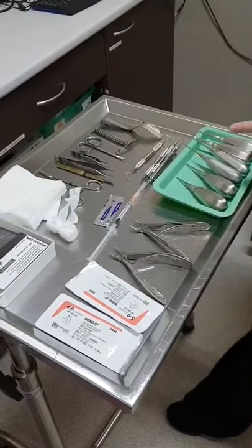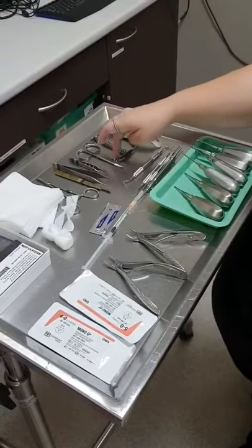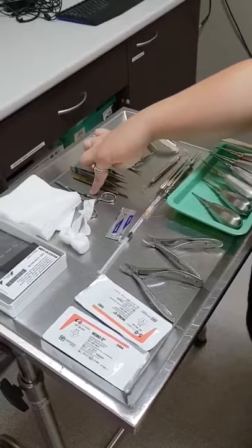We also have our Minnesota retractor, our mouth gag for the canine teeth, our metzenbaum forceps, our two rat tooth forceps, our scalpel holder, scalpel blade, and needle drivers.